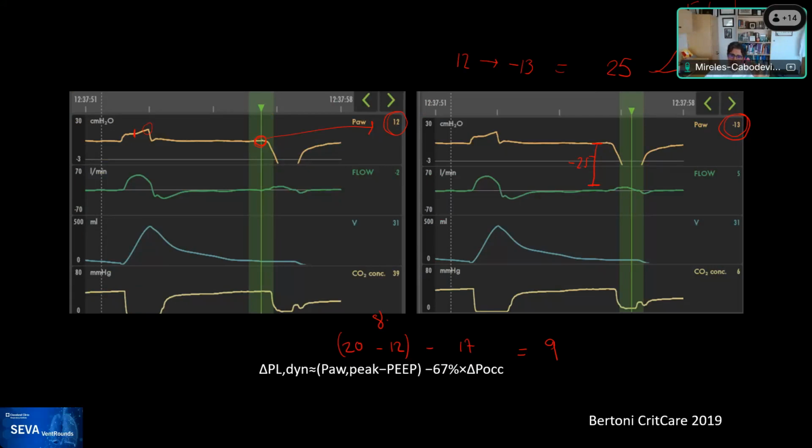But I would again say that what Simran does every day, which is when he approaches the ventilator, you do an end inspiratory and an end expiratory pause. It's a key feature to recognize not only the presence of under assistance, but also the presence of false trigger, which is a huge issue.